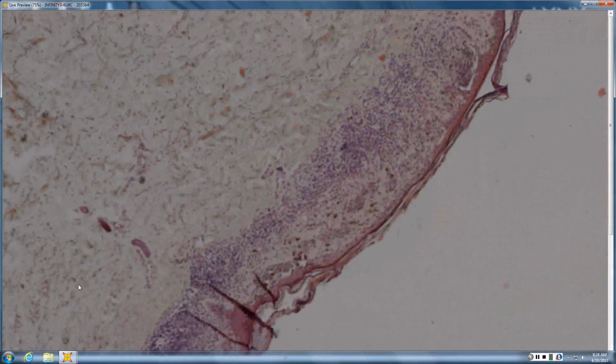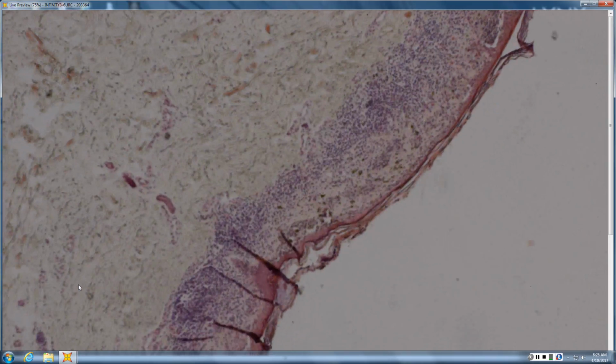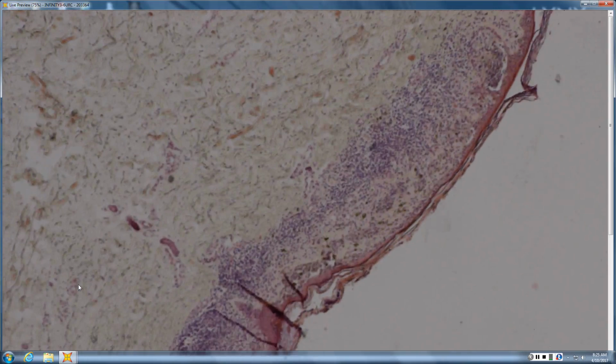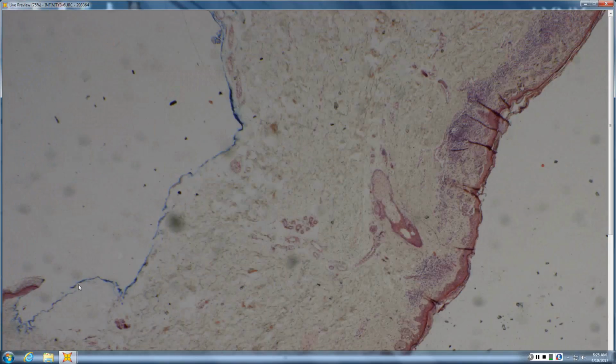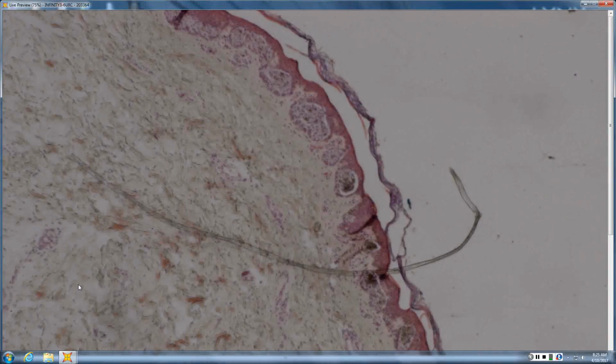So this also looks like it falls into the interface box, kind of atrophic epidermis, could be late stage. There's still a little lichenoid band there. Not quite enough orthokeratosis to give a true red, white, blue appearance, but I would consider LSA. And I'd want to check to see if there's a melanocytic proliferation there, because that's what's concerning. So, as a clinician, when was the last time you took a piece that big for something lichenoid? Yeah, not usually. And then there's definitely nests on that side. Yeah. So what is it? Regression of melanoma. Lichenoid regression of melanoma. So you got a burnt out lichenoid area, but the biopsy is broad. We're on sun damaged skin.